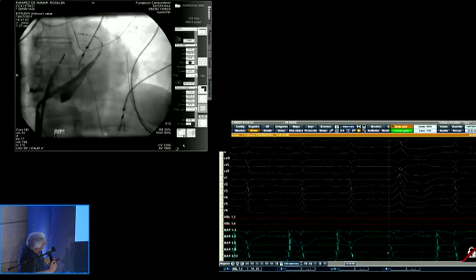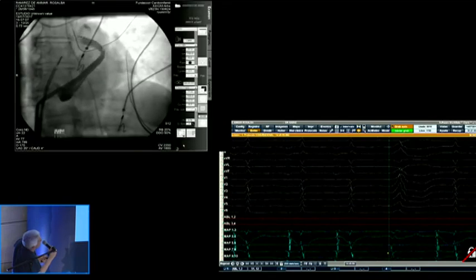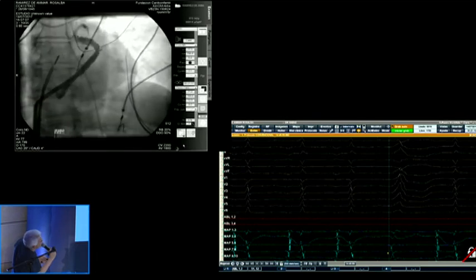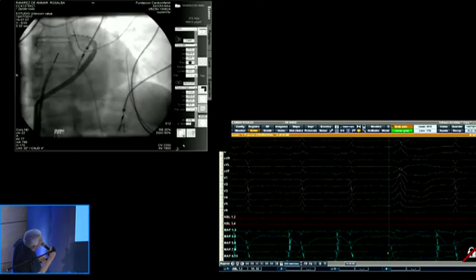There's so much force, we are applying so much force to try to advance the sheath given the circumstances of contraction. This is a patient with left ventricular hypertrophy, and the muscle contracts very strongly, and there are very many bends. The contraction force is so strong that it transmits backward, and you can see how the introducer is kinked. When you are in such a situation and you appear to be early, but you find that you're not going to gain anything in the venous circulation, the best thing, in my opinion, is to go safely in order not to run into complications, and just abandon it and not try to continue to do heroic things here. We made several attempts, so we decided to go out and start mapping from the endocardium.